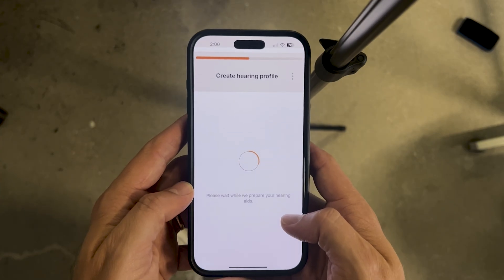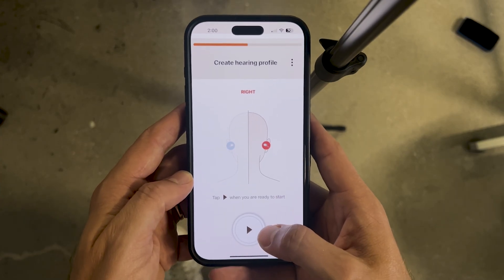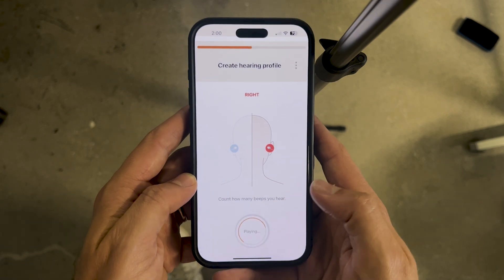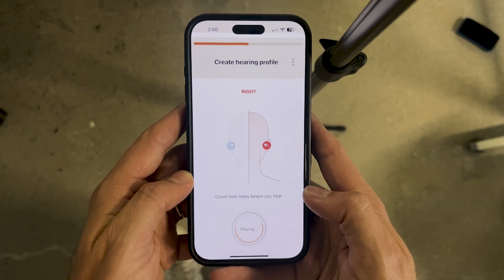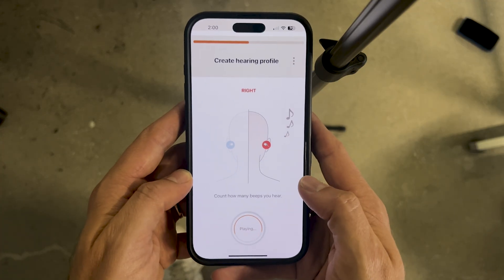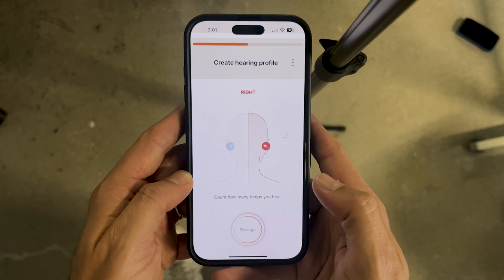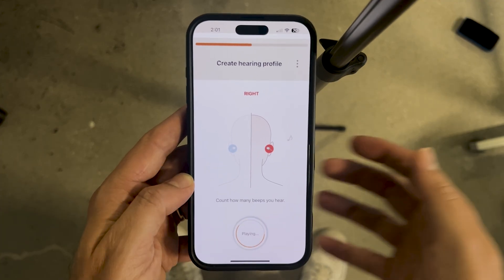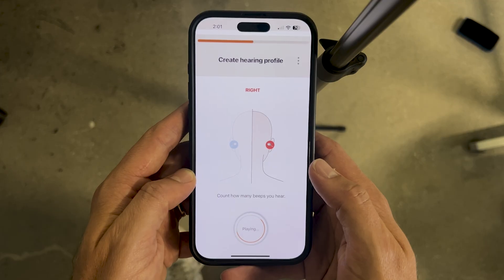During the hearing profile creation, the Sony app will send high-frequency sounds to your hearing aids and present beeps into your ears — in your right ear and your left ear. You'll simply answer the number of beeps that you heard: zero, one, two, or three. You'll do that repeatedly in your left ear and then your right ear, and when you're done, it will sync all of that information into your updated hearing profile.